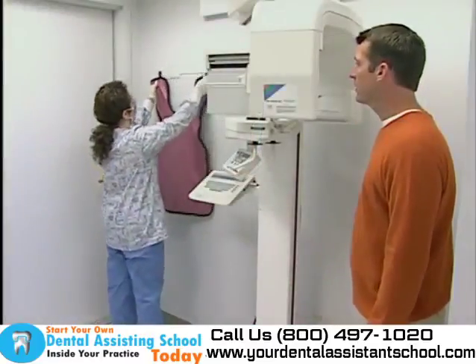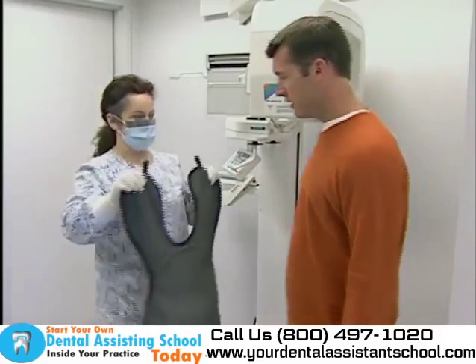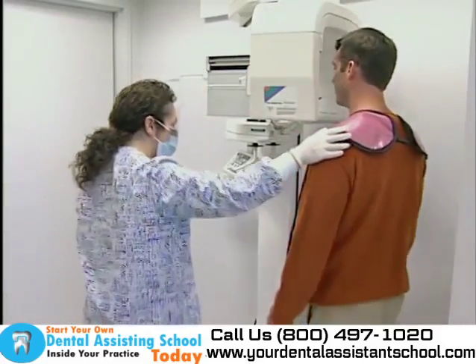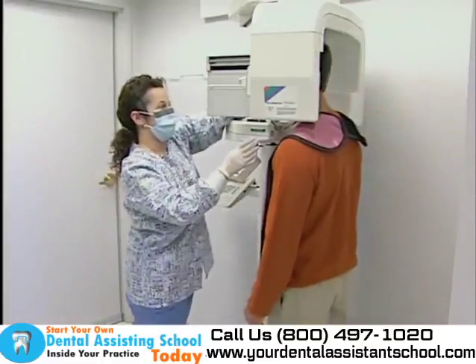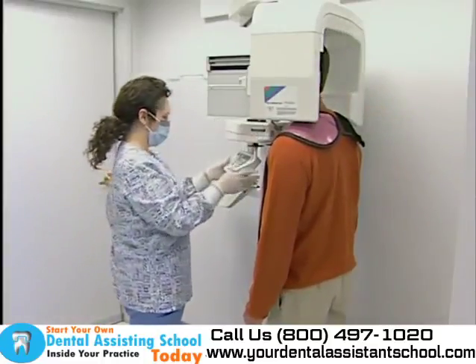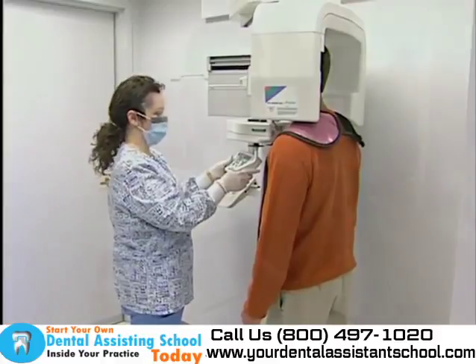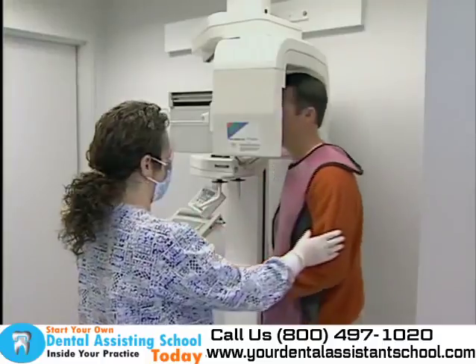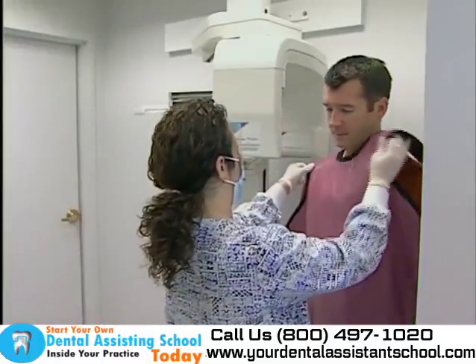Ask the patient to remove all earrings, jewelry, hearing devices, or any other removable head accessory, as they will appear on the X-ray and may block an area that the dentist needs to view. Similar to the standard X-ray machine procedure, the assistant exits the room and exposes the X-ray. When done, the assistant re-enters the room, lifts the machine up, and removes the lead apron.